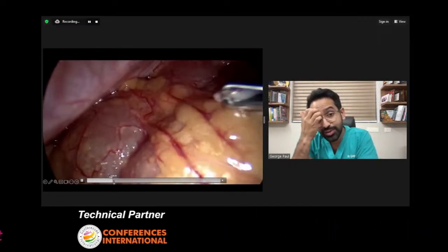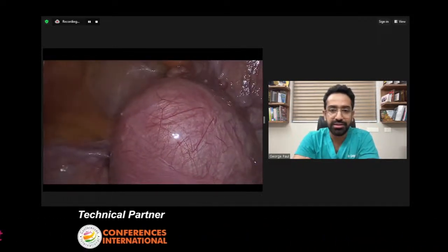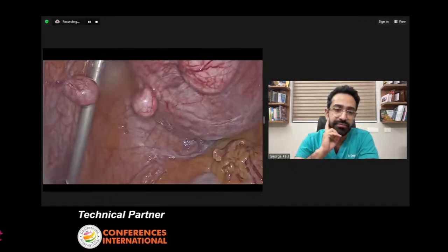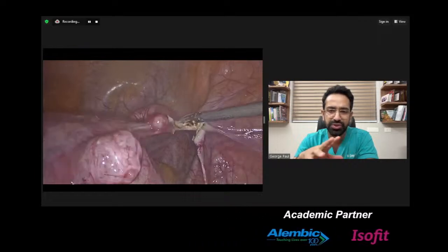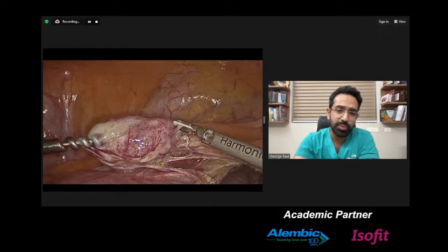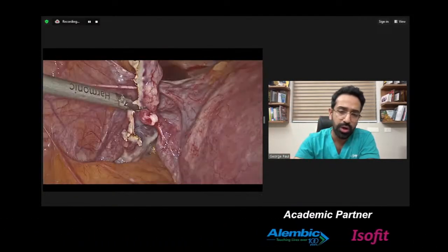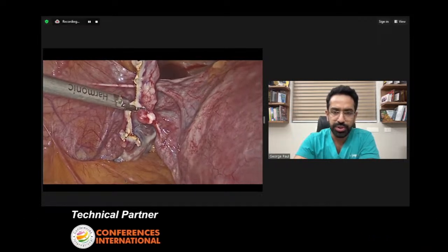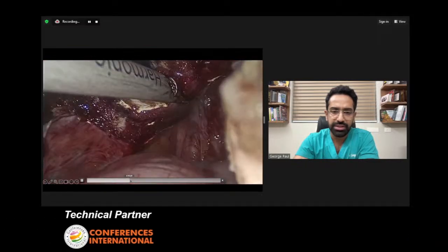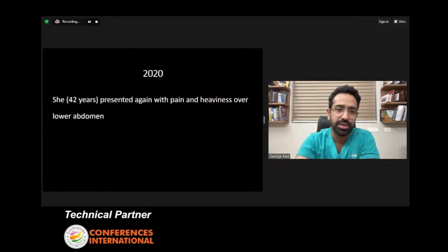But then again, in 2015, she came with heavy menstrual bleeding, and this time we were planning a total hysterectomy. And as you can see, numerous small fibroids scattered along the surface of the uterus, along the UV fold. There are smaller pieces on the peritoneum as well, along the abdominal wall. So the hysterectomy part was pretty much the same as a traditional hysterectomy. I will skip that part, and we went ahead with removing all the other small myomas as much as possible.